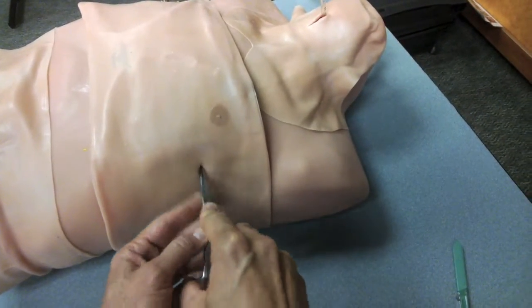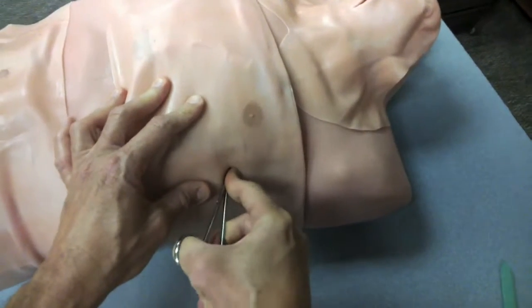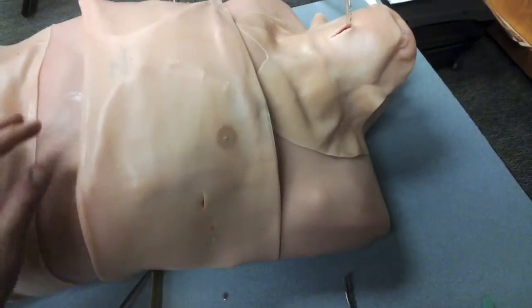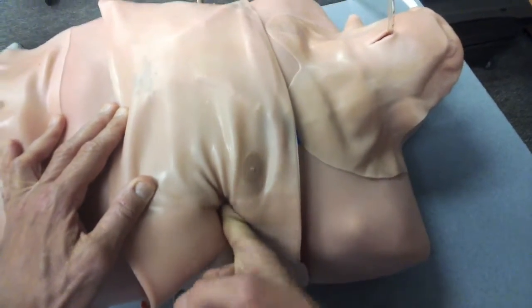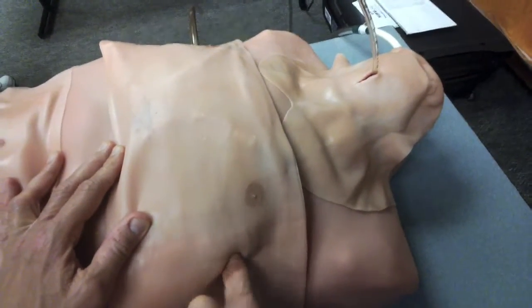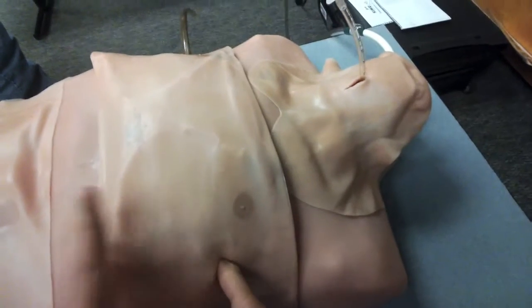You already have your space to put your finger in the incision, and they go in the pleural space to feel the lung tissue. You don't want to put it in an area where you have adhesion.